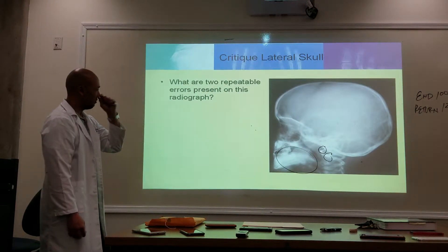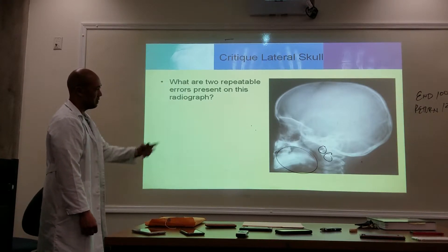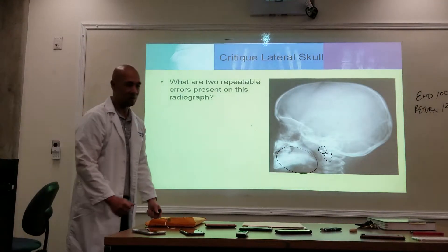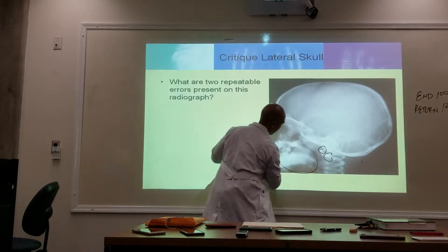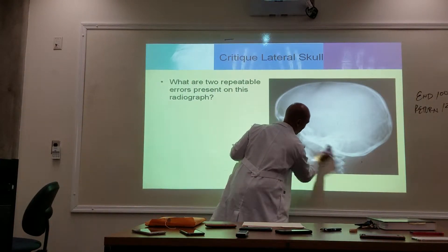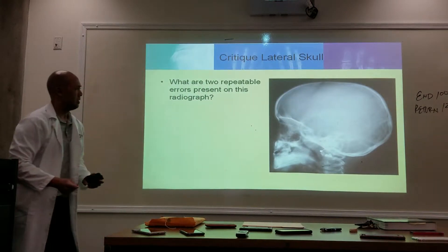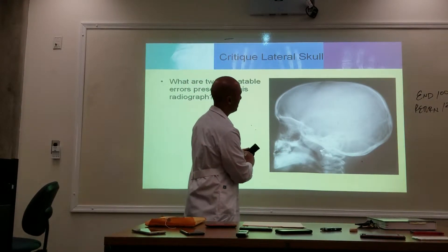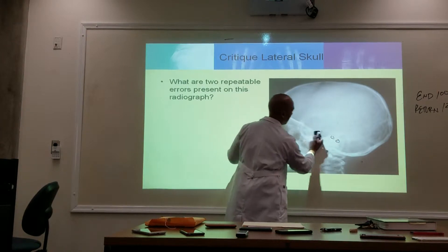They should have removed those earrings. They could have collimated a little bit better, because we don't need to include the jaw. Now we're also shooting the mom and dad's hands — there's no need for that. There might be some slight rotation, because I'm seeing one hole here and one hole here — the EAM.